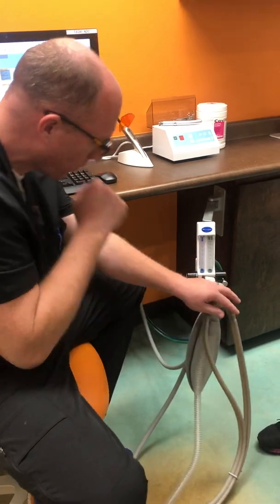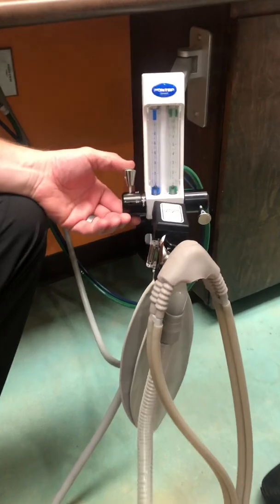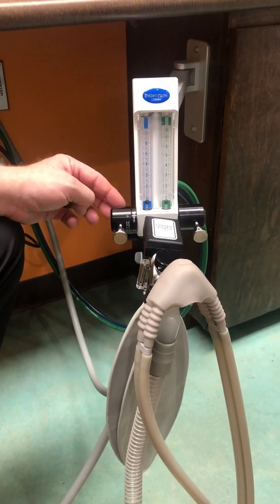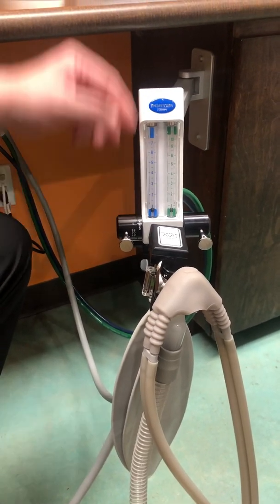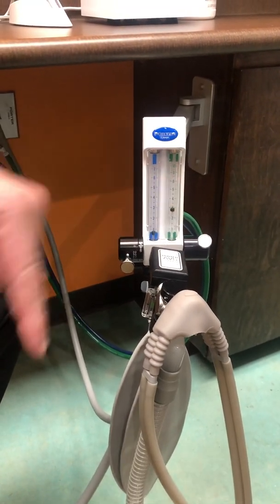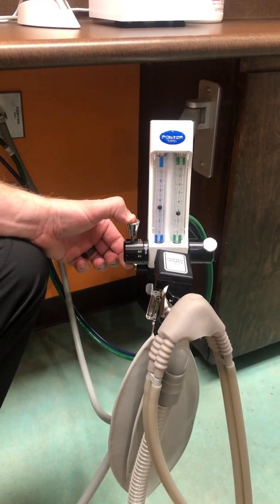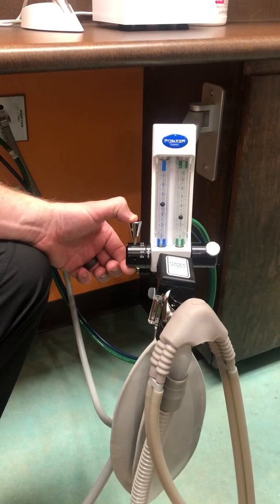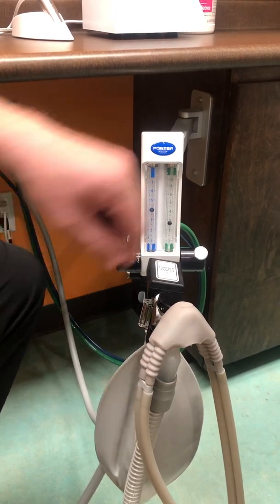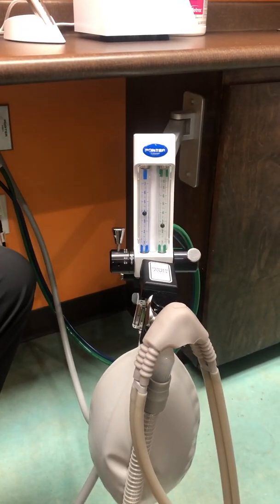As far as our machine goes, when you turn on the nitrous and lift this up, you notice nothing happens. That's because these are designed to not allow just nitrous to flow — you have to have oxygen flowing. To turn it on, you have to have the oxygen going, and you'll see it go up. We run our systems starting patients on 60% nitrous, which automatically means it's 40% oxygen. No matter how you move this up and down, it'll keep that 60-40 mixture if you have it set on 60.